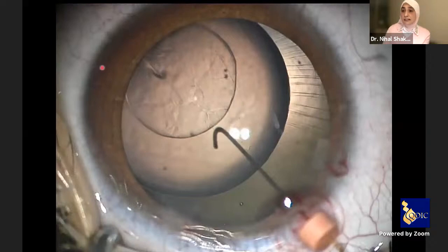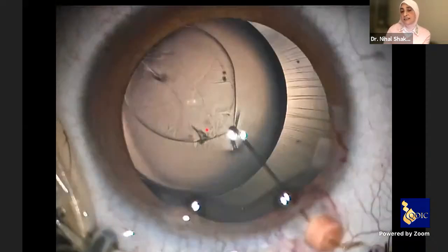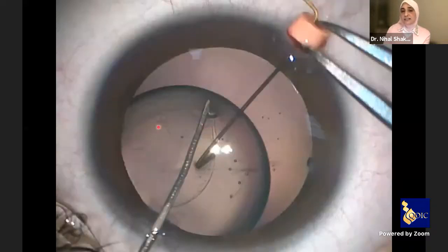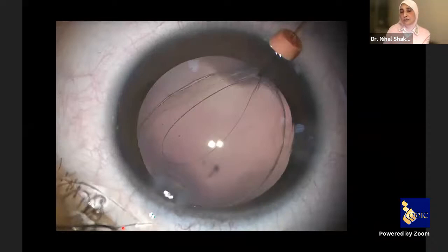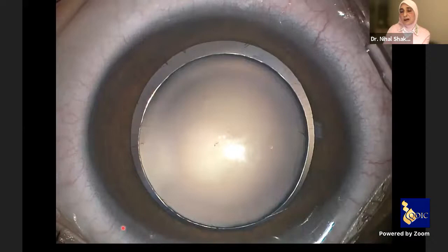If the subluxation is downward, you use a Sinski hook or a dialer to pull the rhexis to facilitate hooking and centralization of the lens. If the subluxation is upward, you use a Y-shaped spatula like this one and push the rhexis towards the hook to facilitate hooking, then continue the surgery. Irrigation aspiration follows, and here is the conclusion of surgery.